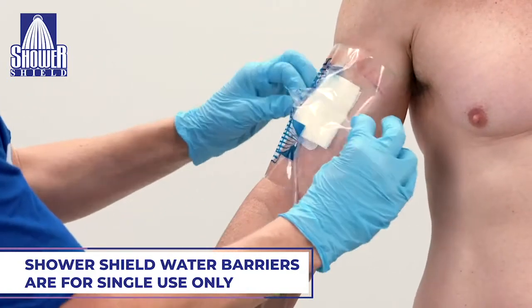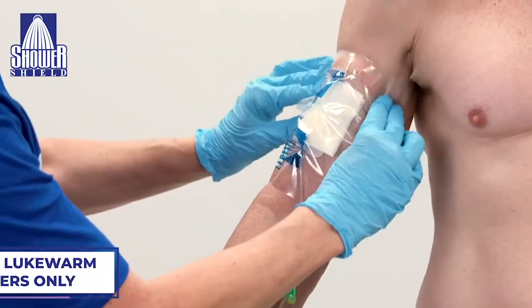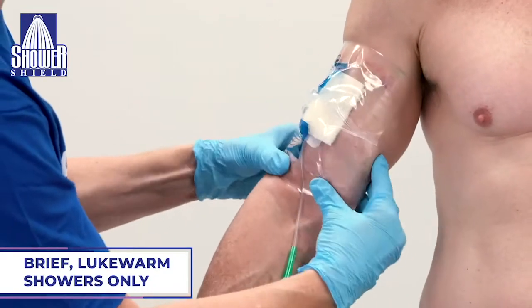Shower Shield water barriers are for single use only, and you only want to take brief showers in lukewarm water to reduce perspiration.